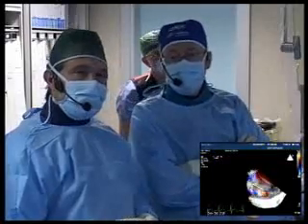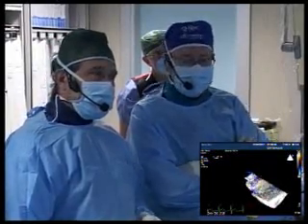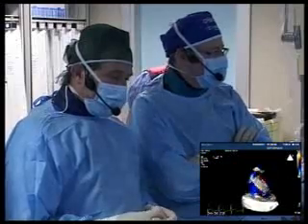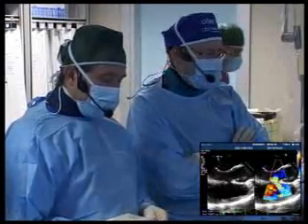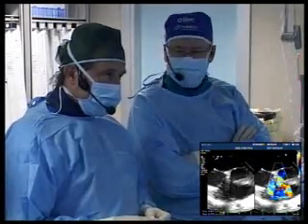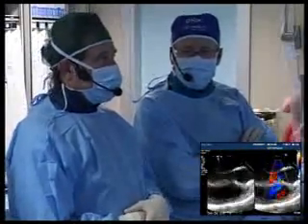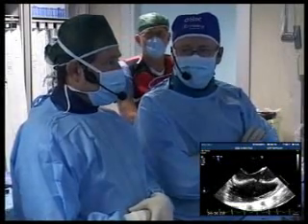Carlos. Yes. Yeah, sure. Muscular or perimembranous VSD device? I think you have enough rim up there, and it looks more circular. And I think I would choose perhaps a muscular VSD. Assuming this is 8 millimeters, I would probably not exceed it more than 12 millimeters. That would be my highest limit. Gerald? Yeah. 12 millimeter muscular, you say? Ideally, I will go with a 10 millimeter VSD, but I would not put larger than a 12.